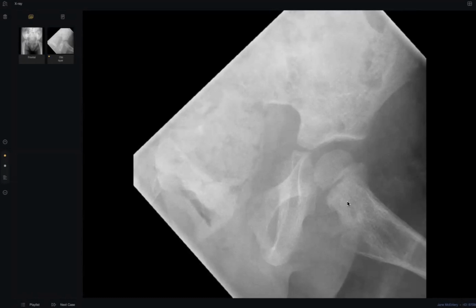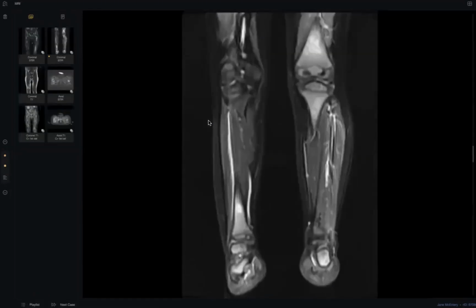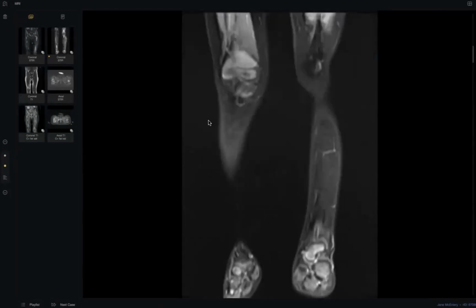Okay, what will you do next? Sir, I would like to do previous radiographic and clinical lab correlation, and then MRI of this region for further evaluation. Okay, could you provide a request with contrast MRI? Dr. Omer, please. Request contrast, please. Sir, I have requested it. Go on.